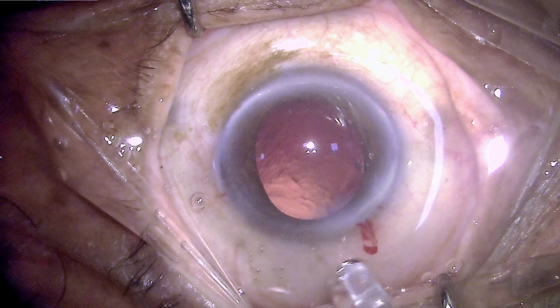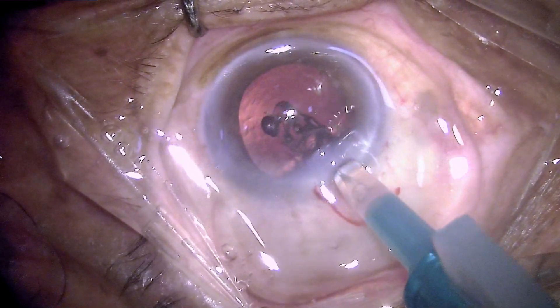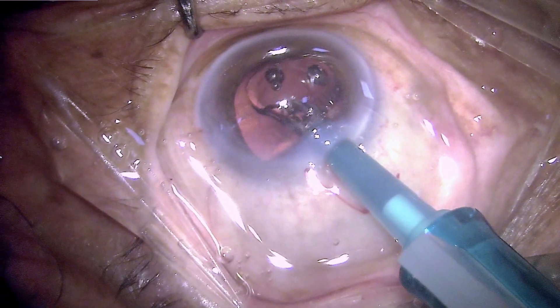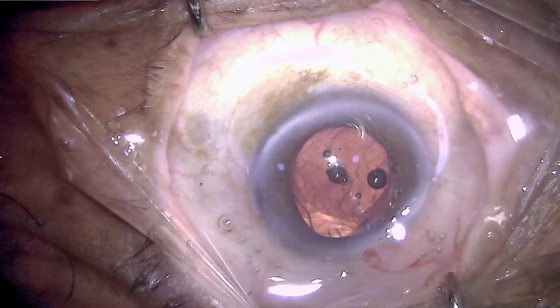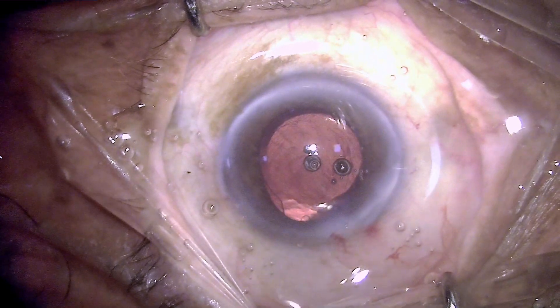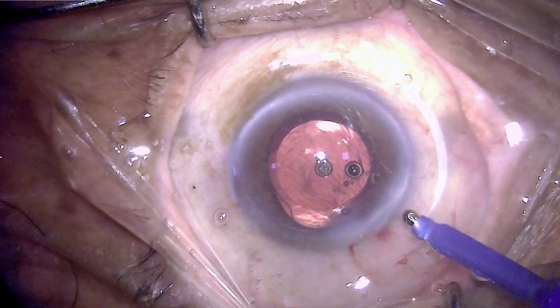Once the anterior chamber has been filled with viscoelastic gel, it's time to implant the intraocular lens. This is a hydrophilic monofocal lens and it goes directly into the bag. Those injector tips which are narrower can be introduced inside the eye in such a way that they simply open and deploy the lens in the bag and you don't need to dial it.